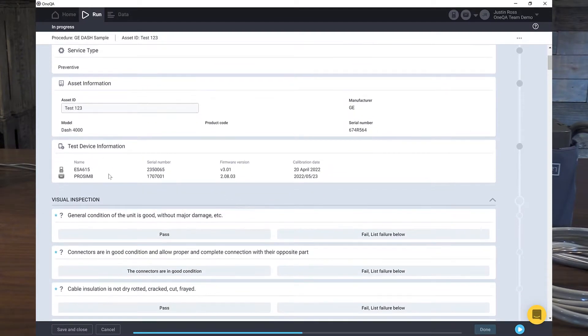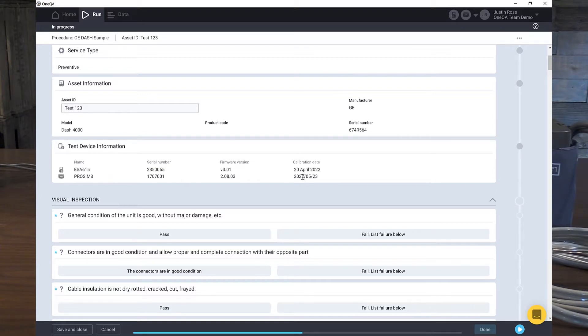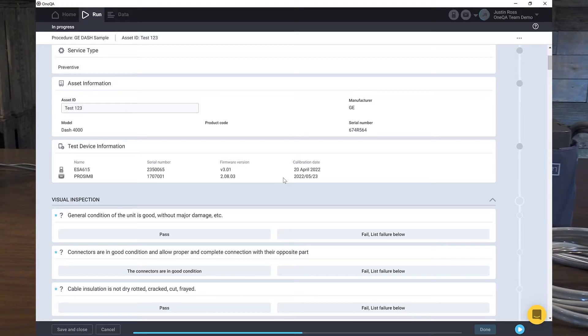The next thing that's really nice is these are the two Fluke devices that are attached to the OneQA software. An ESA-615 safety analyzer. Here's the serial number and here's the date of the calibration. A ProSIM-8, the serial number and the date of its calibration. Now I know that both units are within a year of calibration and I'm good to go with my PM. If I ever have an issue, I can go back and find out exactly which work orders these two devices were used on through the system.